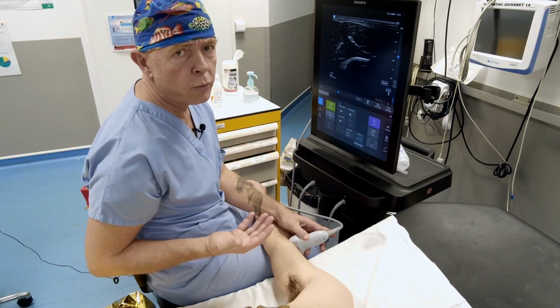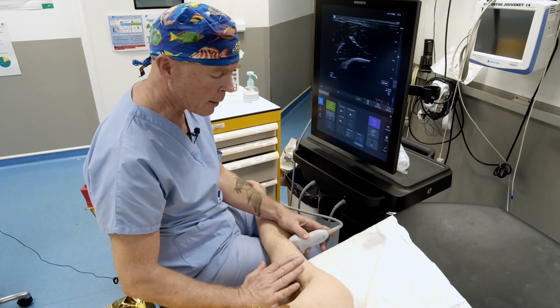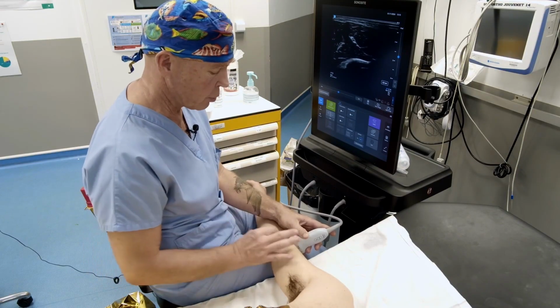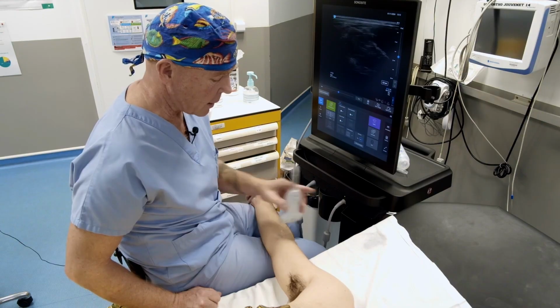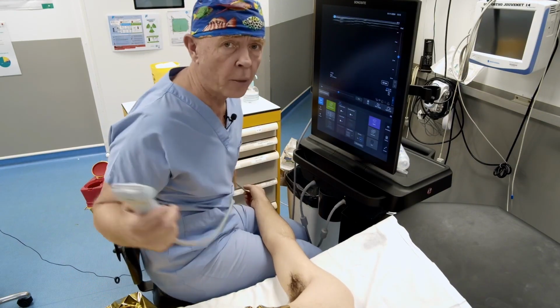Basically, when you start your axillary blocks, it's not very easy. You perform your block at the axillary level. And then if there's one of the structures you didn't see clearly, you keep the position and inject 3 to 4 cc. For the additional injection at the elbow, we'll take this opportunity to show you the last one, and all of this will really help you achieve 100% success at the beginning.